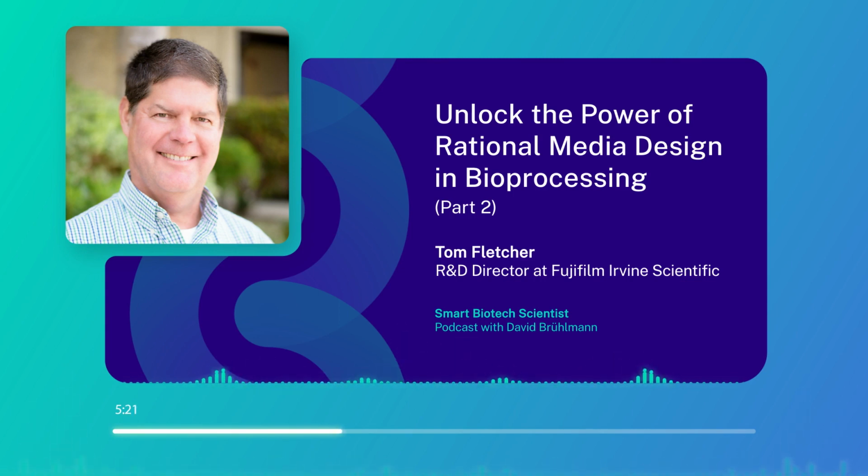Once you've done that, I think the next step would be make sure I've got some screening methods or testing methods that are relevant so that the endpoints I'm measuring are relevant to answering my question. Again, I'm surprised when people just take an existing assay and say, well, even though it's not that relevant, it's a standard practice, and so I'm just going to use this method for testing. Well, you're probably not going to be very good at finding the answer if you're not using a relevant method.